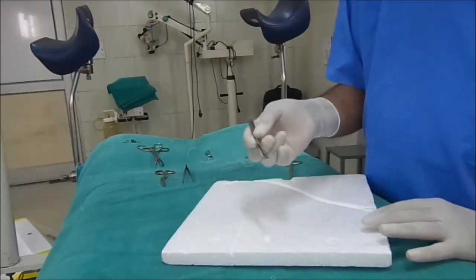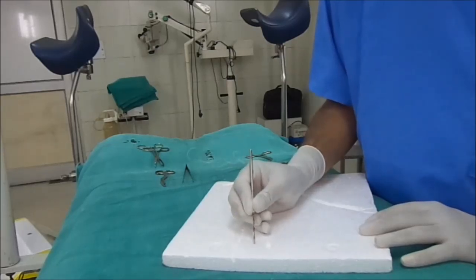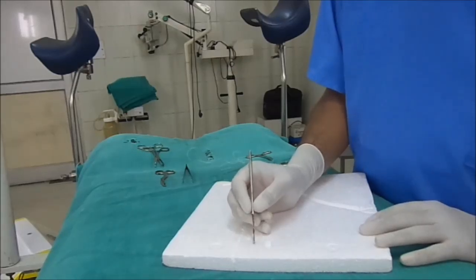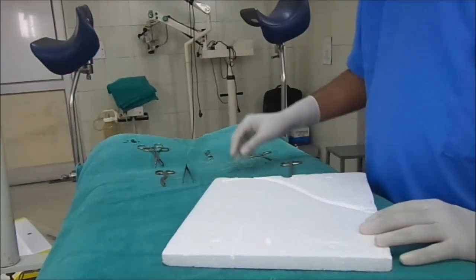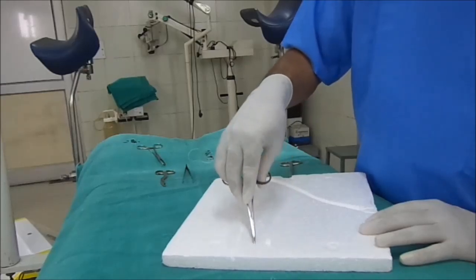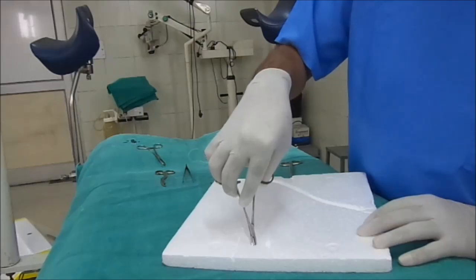I will show you that later on. We make the incision just like that — first go deep, and when the resistance is lost, just make a nick. Finally, the cavity should be dilated by using artery forceps or mosquito forceps.